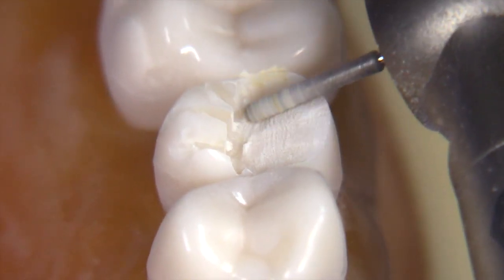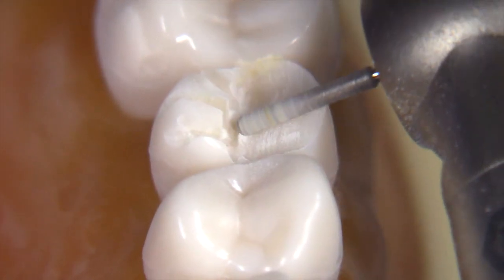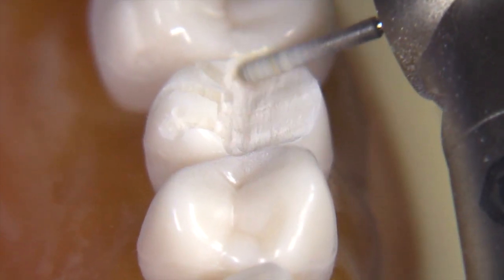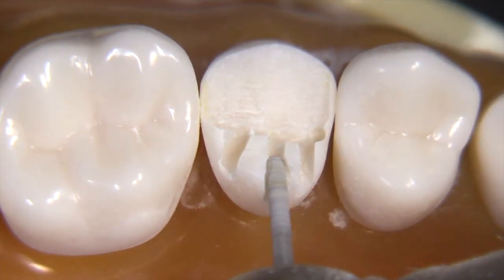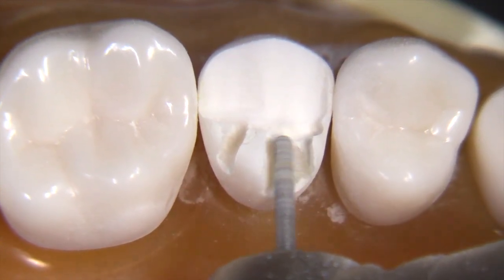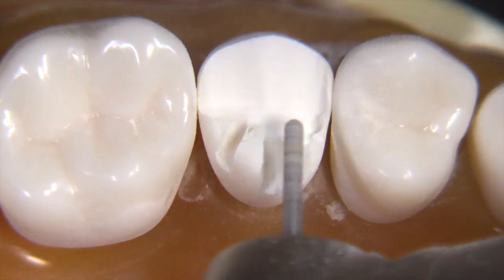Obviously, if we're performing this procedure in the oral cavity, we are going to be utilizing copious amounts of water spray. I always find it easier to teach with a dry reduction technique because you can see more as a student or observer, and I can also see more as I'm making the video.